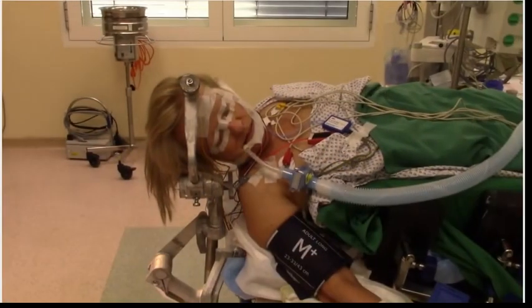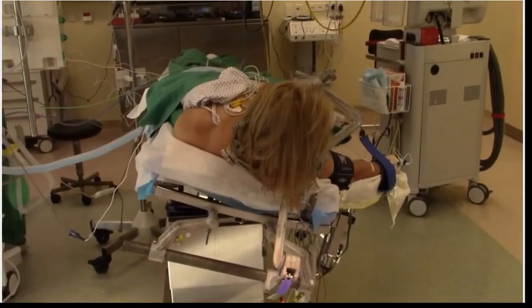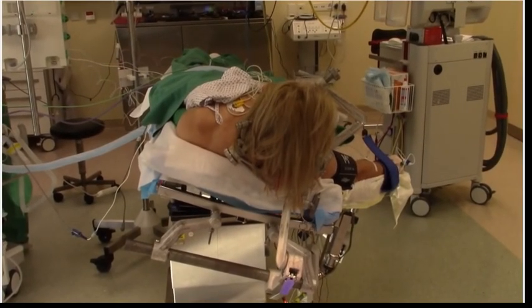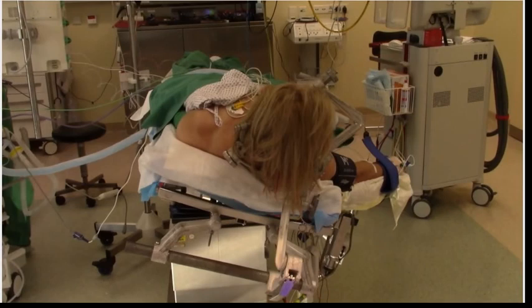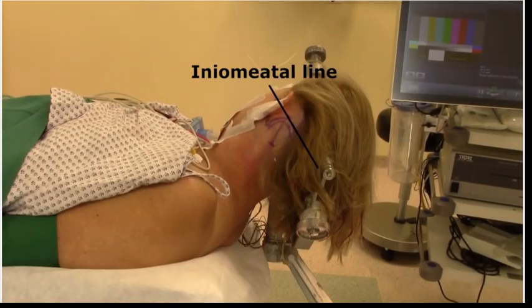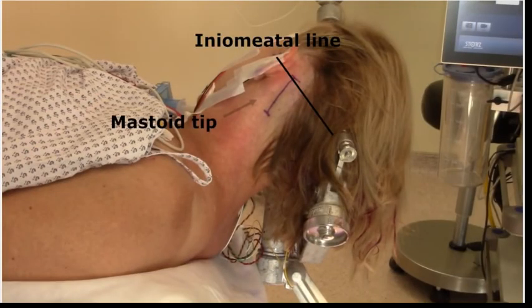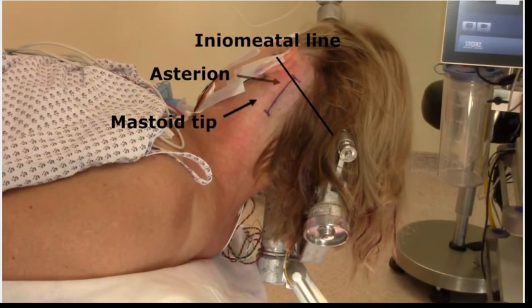The patient's head is rotated 45 degrees to the contralateral side. Furthermore, the operating table is tilted 30 degrees to achieve a maximum of retraction of the cerebellum by gravity. For the approach, the surgical area is shaved and the approximated course of the sigmoid and transverse sinus along the anatomical landmarks, the inion-meatal line and the mastoid tip, are marked. The sinus knee is usually located in the area of the asterion.